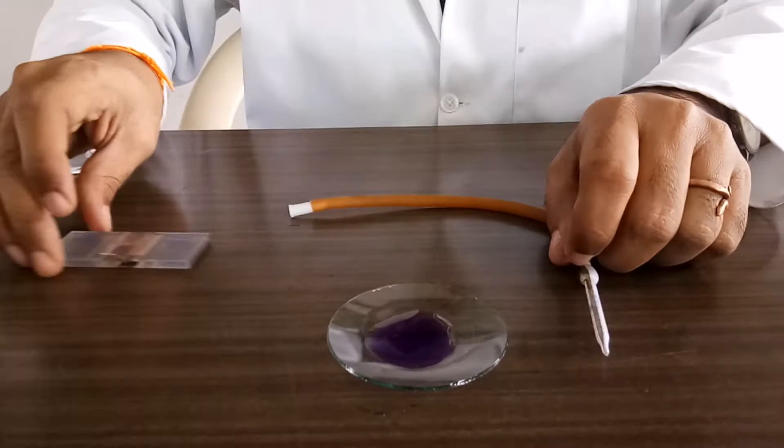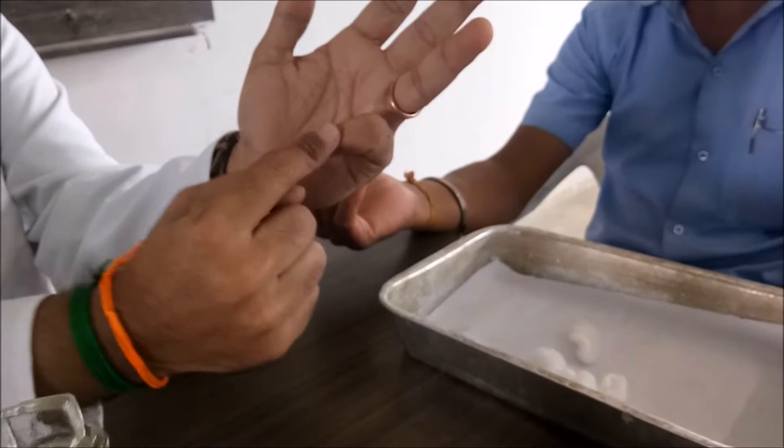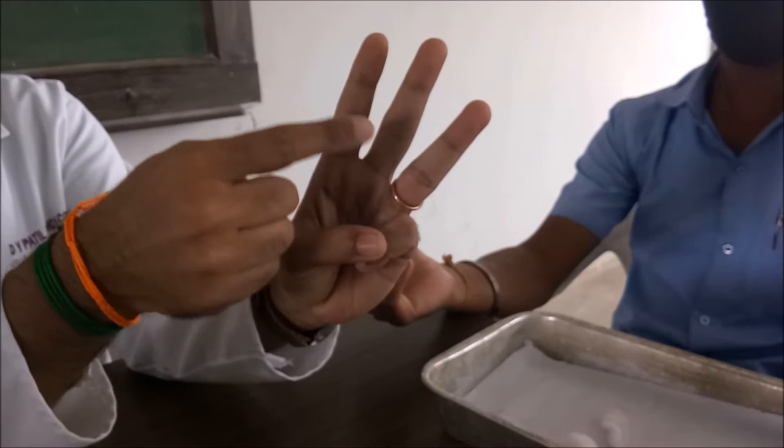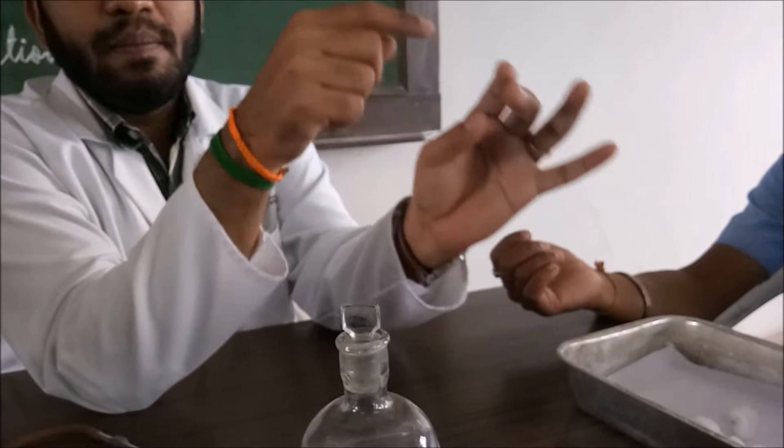Now we are going to take the blood sample from the subject. Subject will be there or you can choose your own finger. Remember, little finger, thumb, these two you have to ignore. You can choose among these three. Preferred finger is ring finger, middle finger. Once you have utilized these two, then you go with index finger. So most preferable finger is ring finger. Tell the subject to show the ring finger like this.